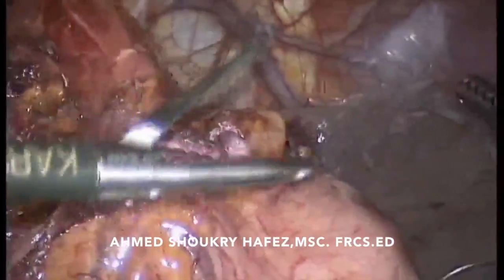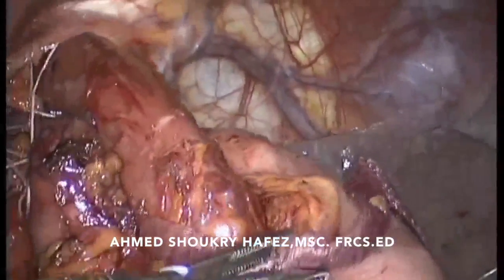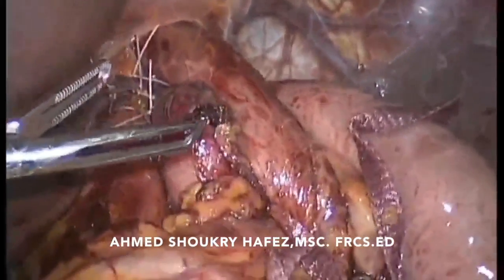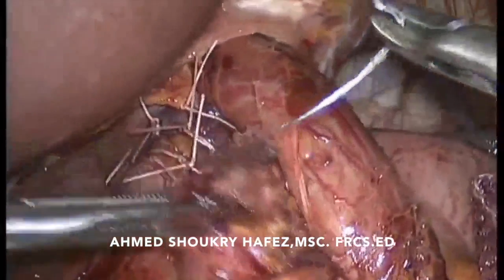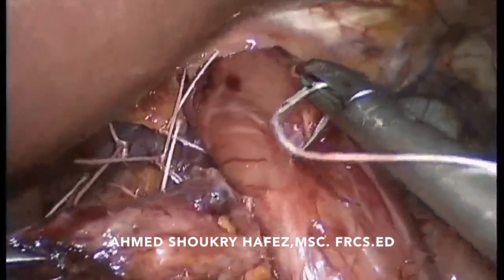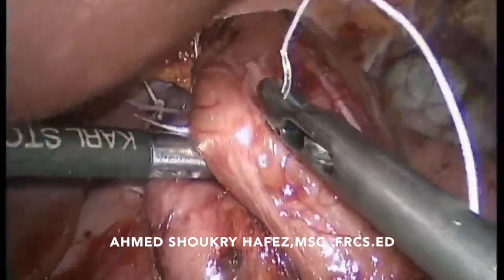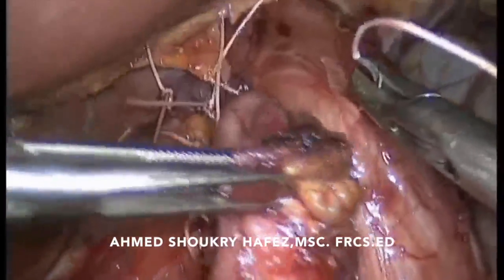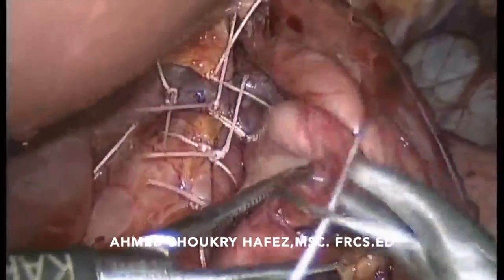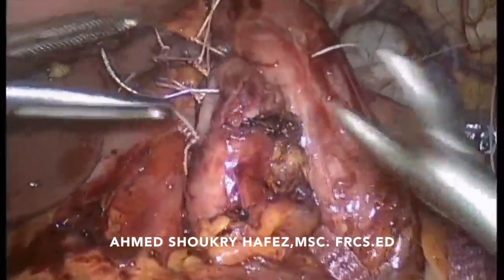Now, as the wrap has been fixed posteriorly, the assistant must take the tape on the gastroesophageal junction and fix it inferiorly, so as we suture the wrap to the lower end of the esophagus properly, not to the stomach. This is a very important step in either Nissen fundoplication or Toupet, that the assistant takes the tape, which is on the gastroesophageal junction, inferiorly with tension, so as to put the wrap in the lower end of the esophagus proper. We start by fixing the esophagus to the wrap on either side, leaving the anterior part of the esophagus bare without wrap around it, just a 270 degree wrap.